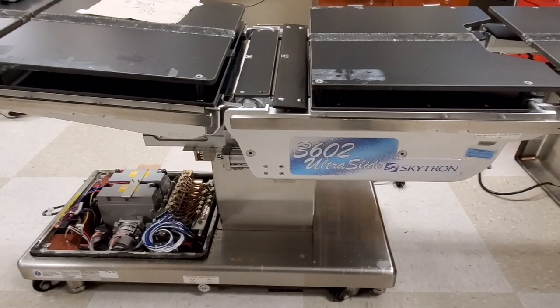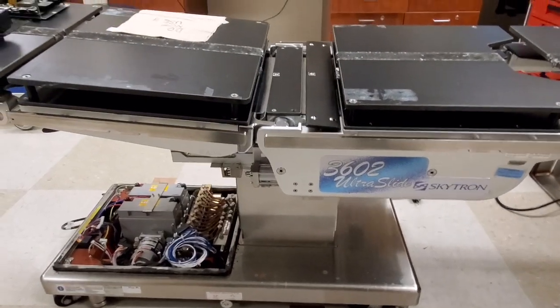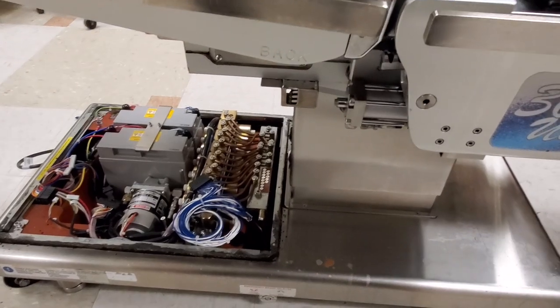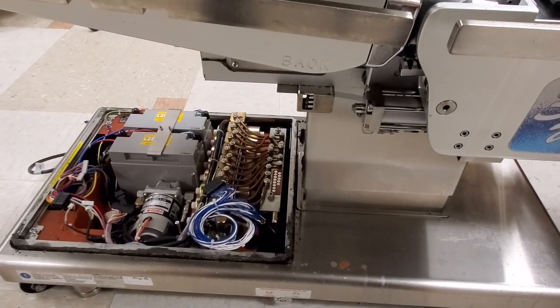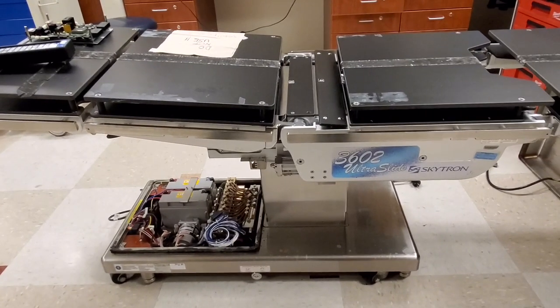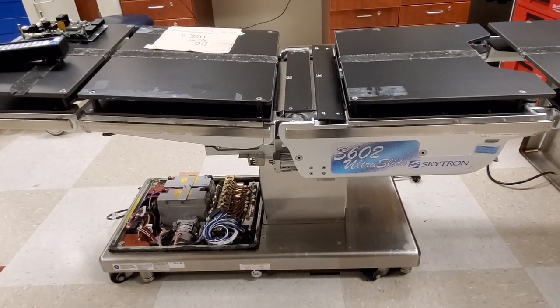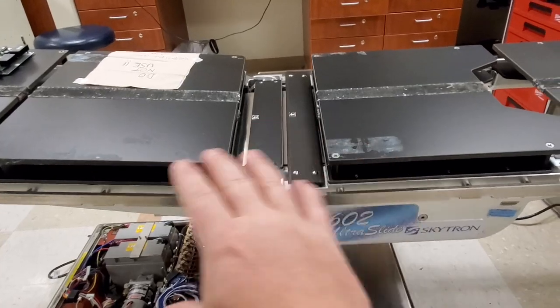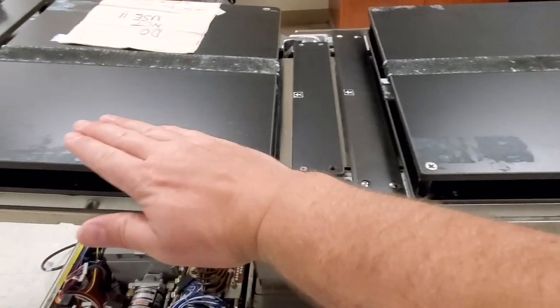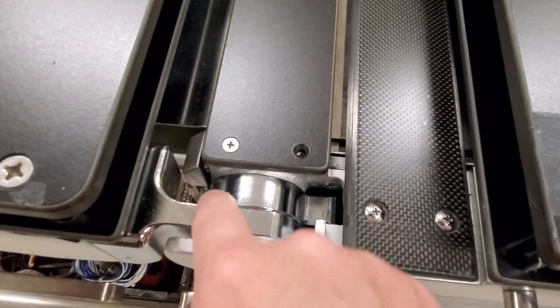This is the Skytron 3602 Ultra Slide. I've given you problems before with the slide and how we have to open up the hydraulic valve assembly and do some maintenance — clean it out. But this time I've got a whole different problem. Yesterday I had a table exactly like this, same model.